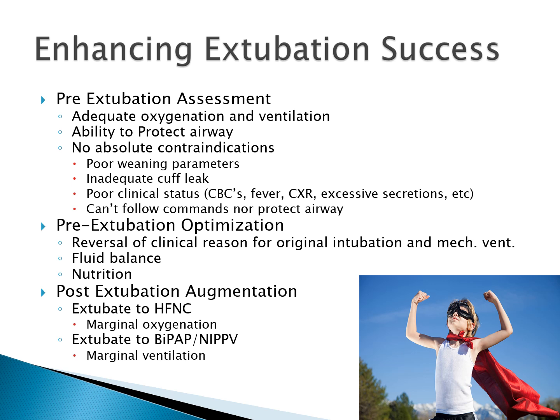When you're using an invasive ventilator to non-invasively ventilate a patient with a double limb circuit, you should not, and you do not have to, have that exhalation port. So many times you either use a different interface or the interface should be adapted appropriately.